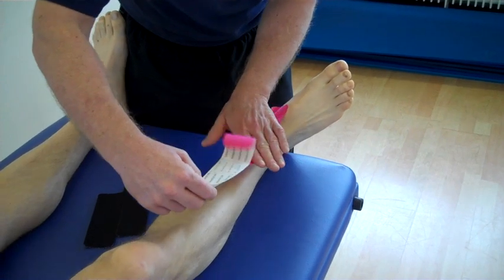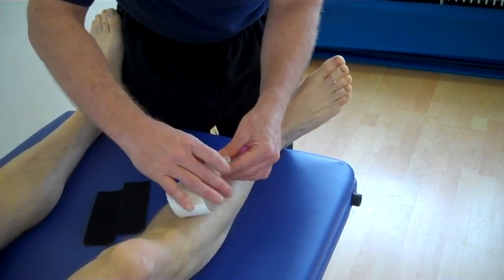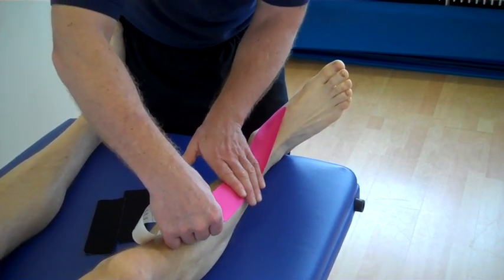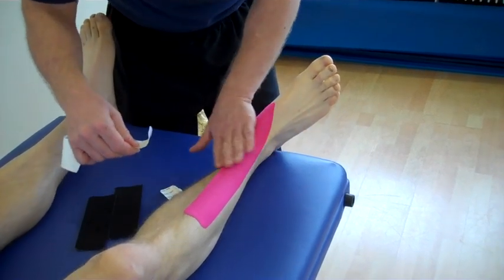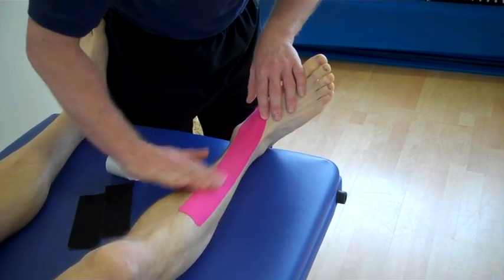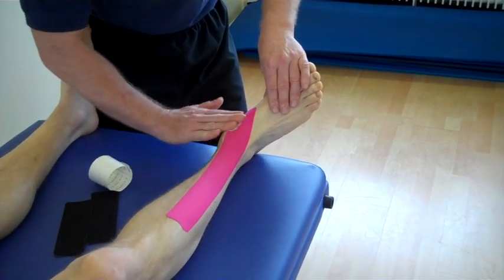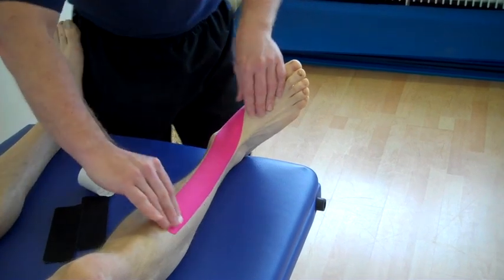We feed the tape out towards the end and because the tissue is already on stretch, we literally just mould the tape along the course of the muscle, like so, using a piece of old tape tissue.